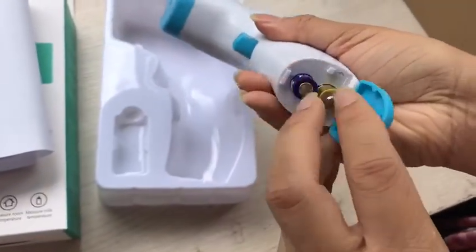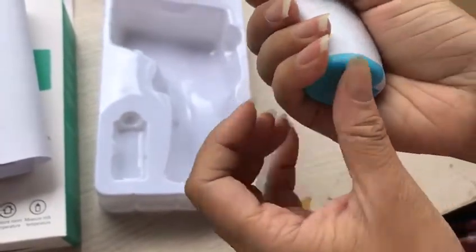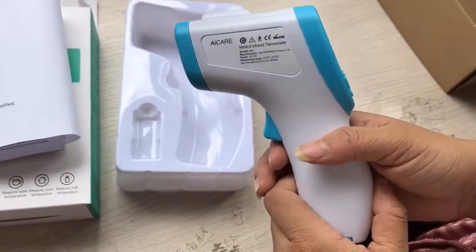Put the battery in. Please note that the battery is not included in the package. You may buy it yourself at your local place.